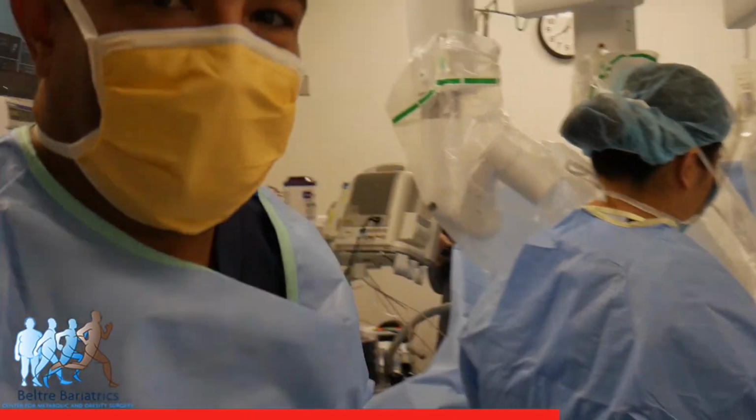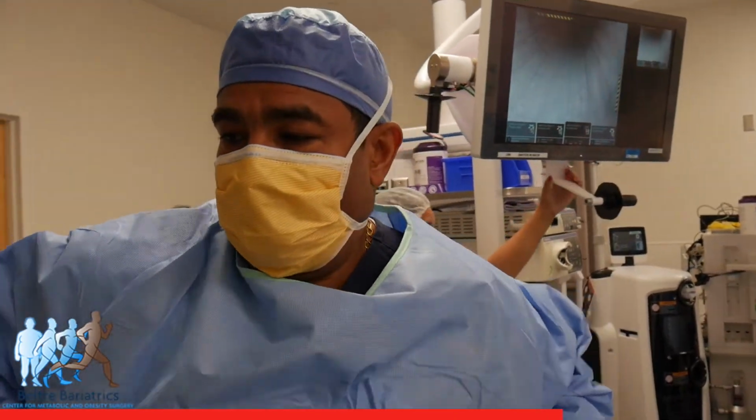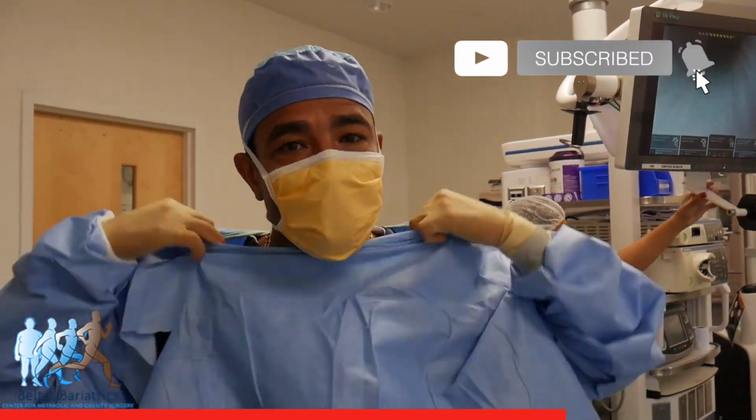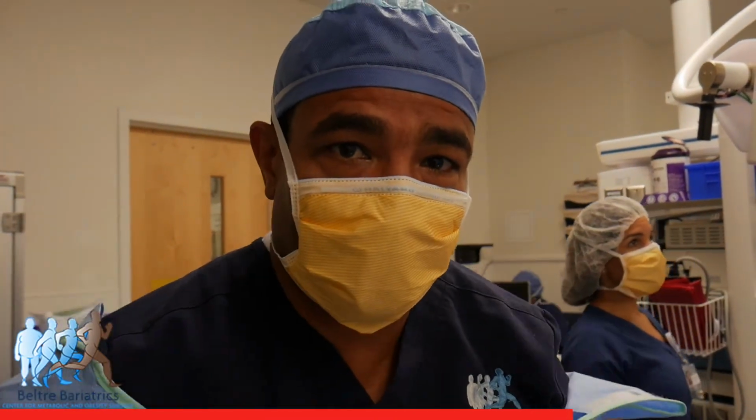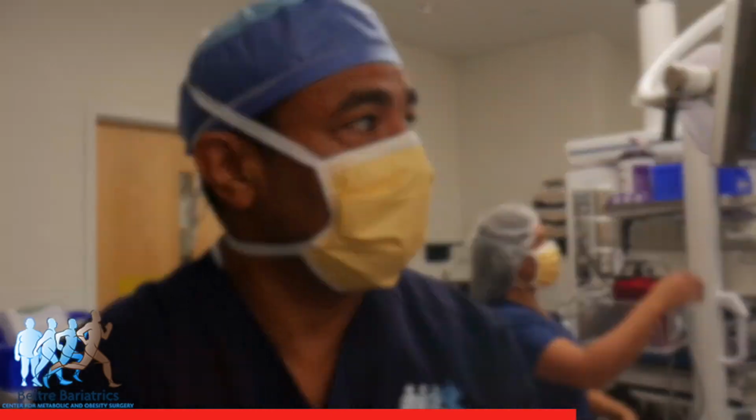So now I'm going to scrub out and then go to the surgeon's console. Ahora salgo del caso y me siento en la consola allí a hacer la cirugía después que yo pase los instrumentos.